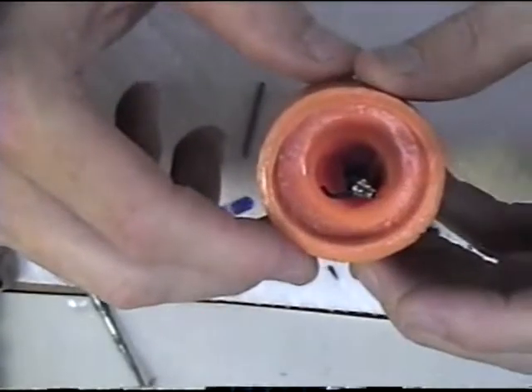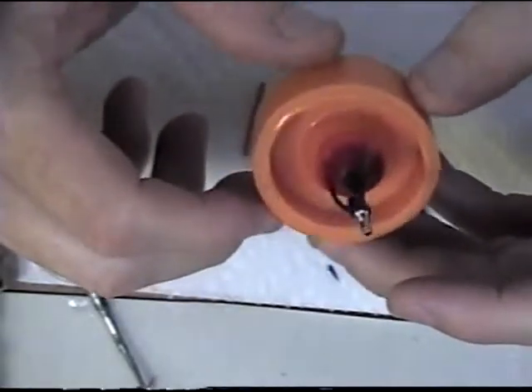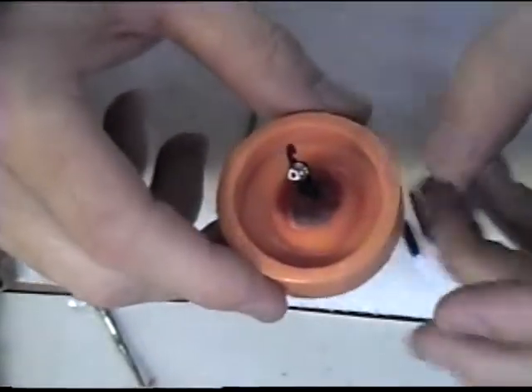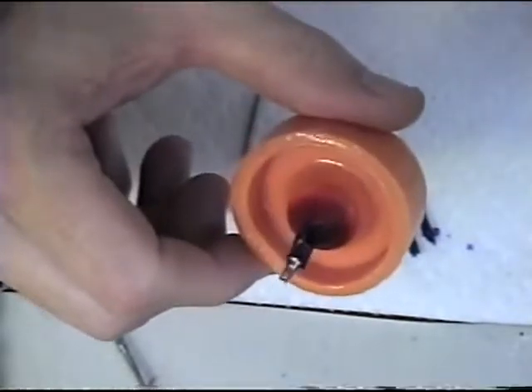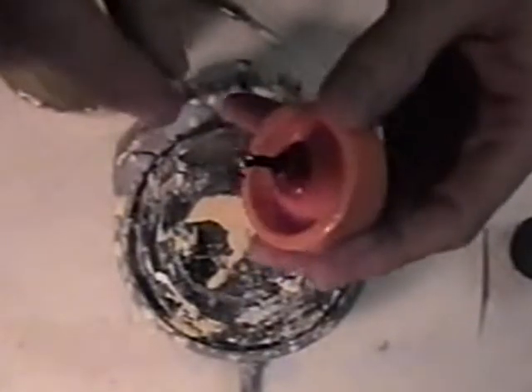I'm going to start getting ready. I'm going to mix my investment up and then we'll take a look at how we invest these. I've mixed my investment up and I've sprayed the abutment on the inside and all around, even underneath into the hole. I sprayed that with the bubblizer. I'm going to blow off the excess now.